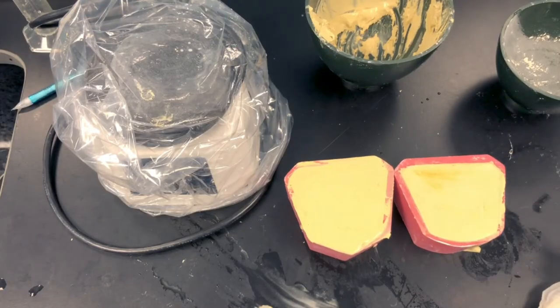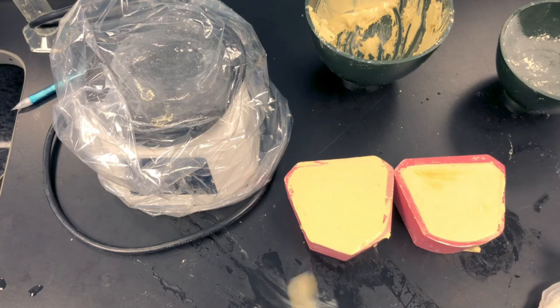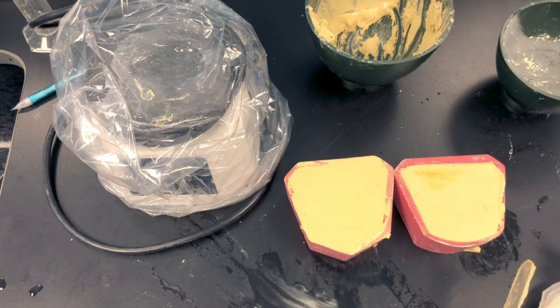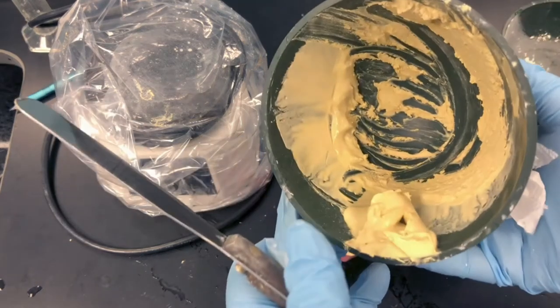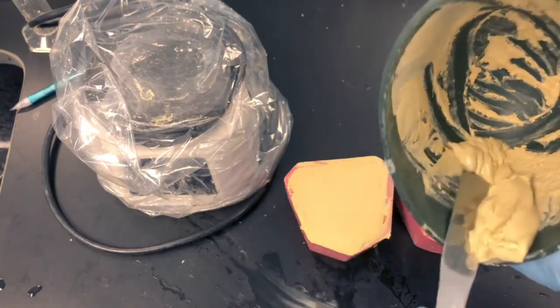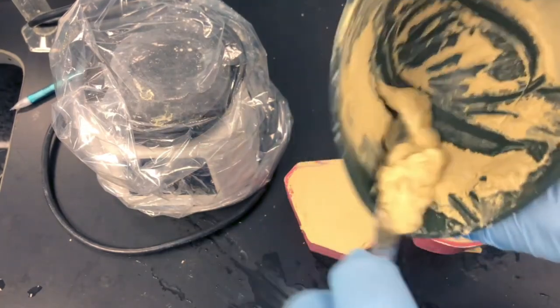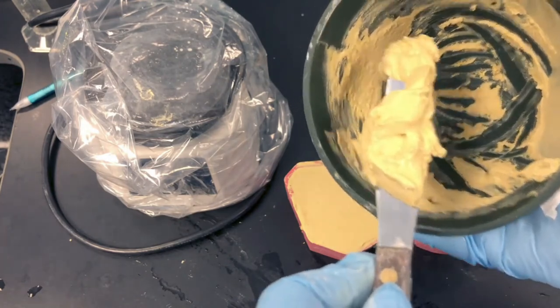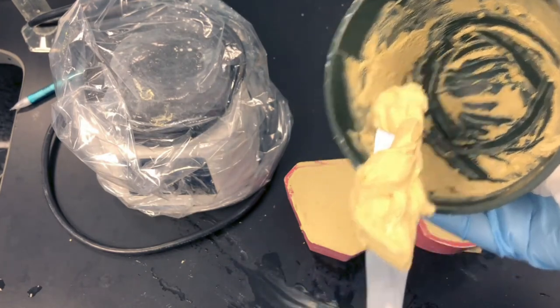And there I have both of my impressions poured up. Once enough time has passed, I will take them out of the molds and we can see how they look. Remember to take your extra stone and throw it away. Don't let it go down the water drain. Regular trash, and then rinse it out in a sink with a plaster trap. All right.